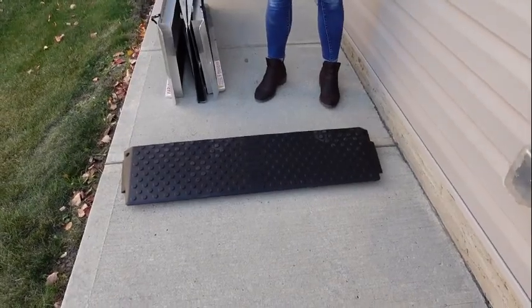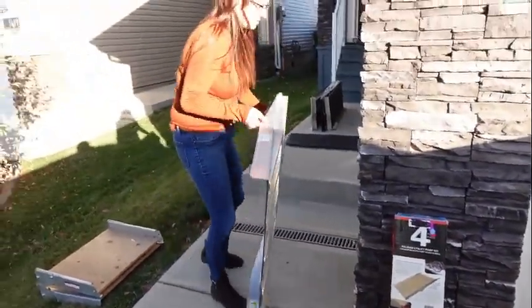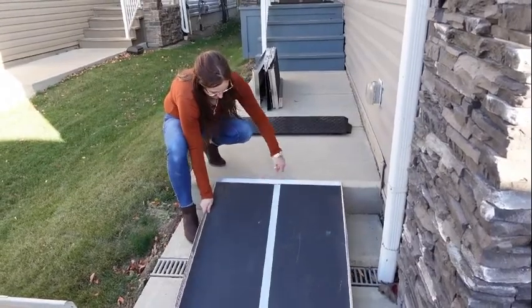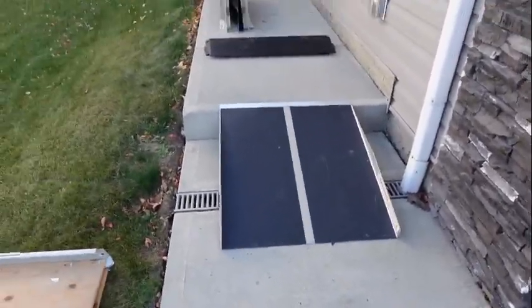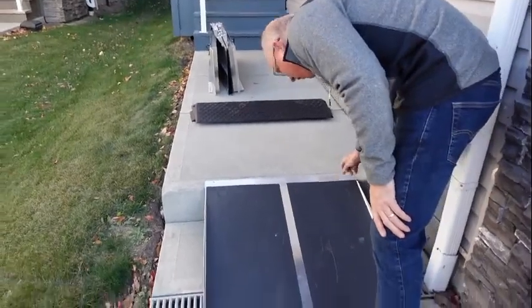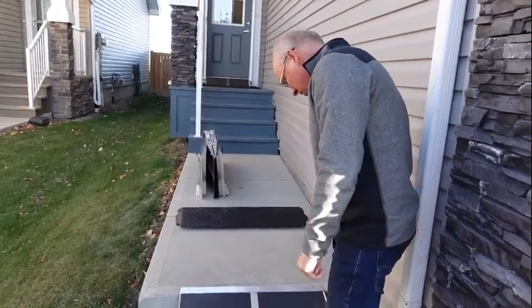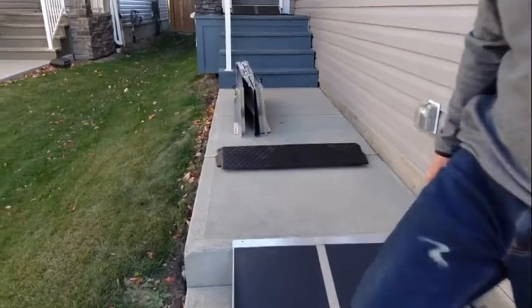Those rubber ones are really neat but they are heavy. Now this other one doesn't fold — it's kind of like those eight-footers, only it doesn't fold. This ramp is all aluminum with grip tape on it. You can drill it through so it doesn't move. If you're worried about it shifting, you can put a concrete screw in there and away you go — it stays in place, or if it's wood decking, whatever you need. They have holes already made for fastening.